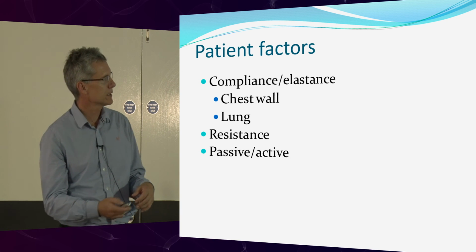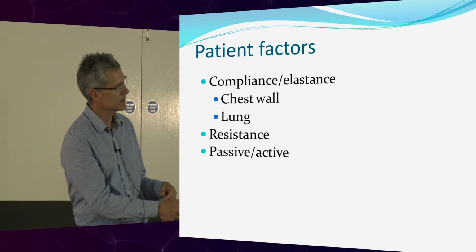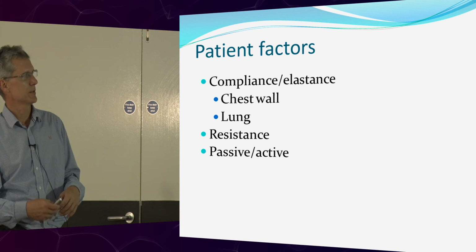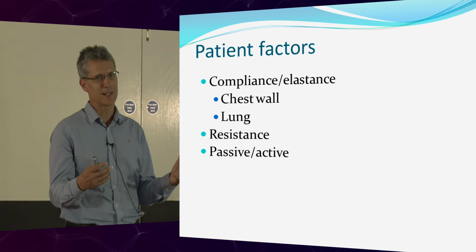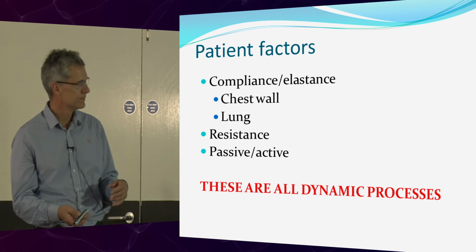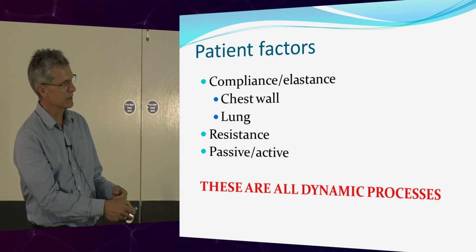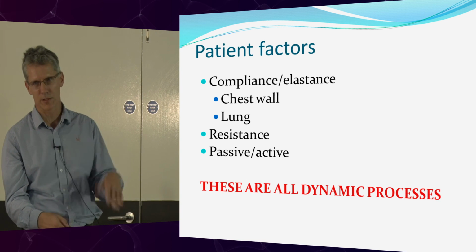Yeah. Patient factors. This is something else which is obviously not talked about, the compliance, so the chest wall, the lung resistance, and whether the patient's breathing or not. So sometimes you've paralysed them and ventilation is a piece of cake. They start waking up and interacting with the ventilator. It becomes a nightmare. These change all the flipping time. Yep. You might have a little bit of secretion. Your resistance goes up. Yeah. If you're on a fixed pressure mode, your tidal volume is going to go all over the place.